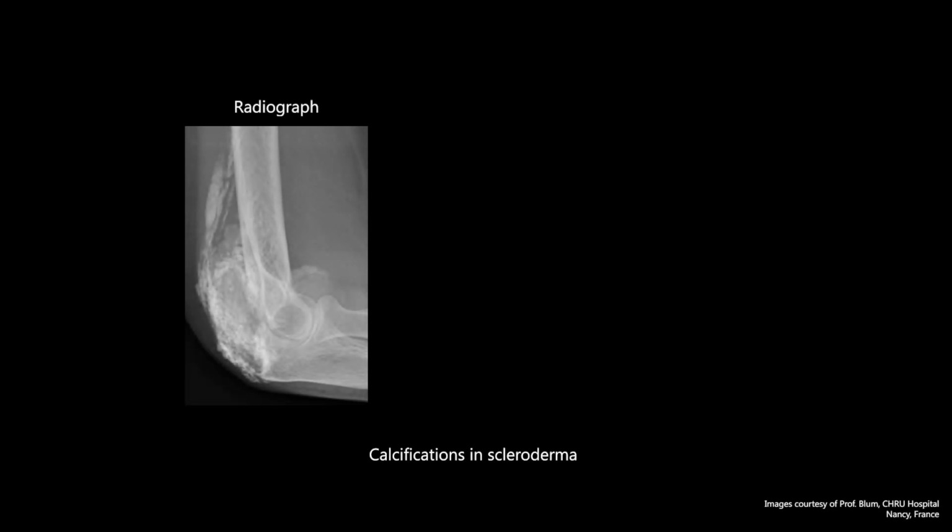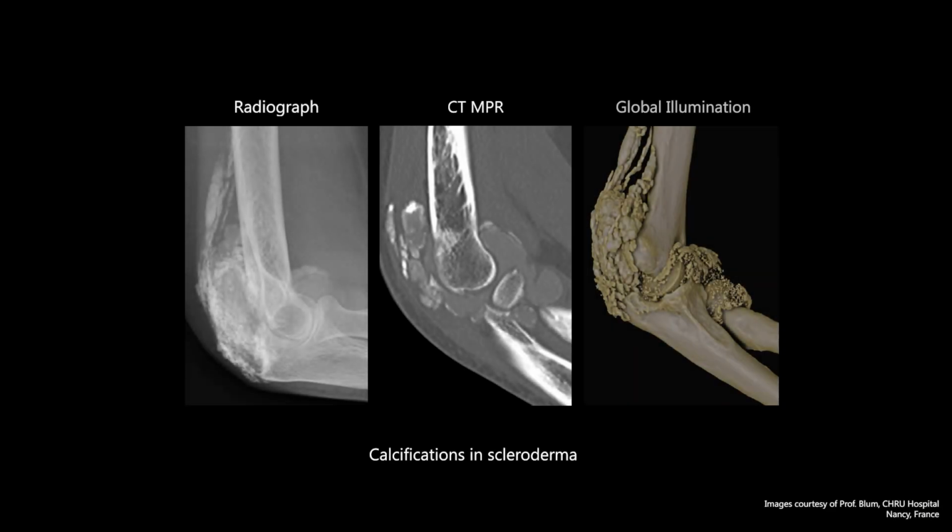Well, right now we use it on a daily basis, on a routine basis, for all MSK cases, as well as all forensic cases. And every time we have a hypervascularized lesion in the abdomen, it's a good way to clearly show the relationship between the tumor or the lesion with the other tissues. It's much easier to perform compared to volume rendering technique because, once again, the image quality is much better.